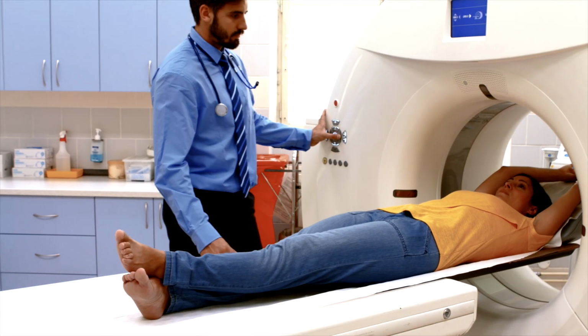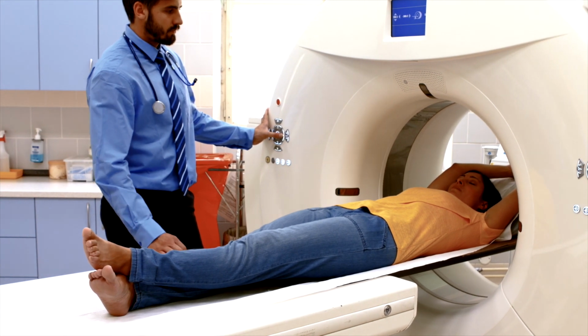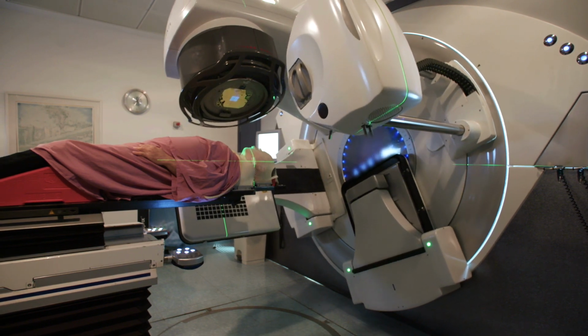So that does happen. An MRI is also a little bit longer than the rest of them. An X-ray and a CT scan usually take a few minutes and it's done. Sometimes a CT scan takes a little bit longer, an X-ray is pretty quick. An MRI can take, depending on what we're looking at or how much we need to look at, hours. I've seen MRIs take an hour and a half if we have to get a really good picture of something. And so that's another reason why it can be kind of onerous for you as a patient. So these are things that patients come to me about, and I try to explain it to them so they know what they're getting into, so it's not a surprise when they come up.